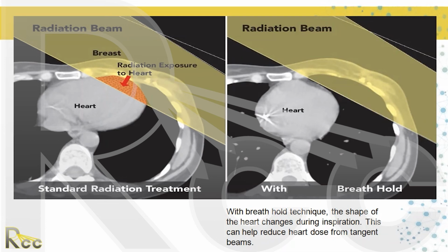So the doctor is responsible for defining the tumor, and the doctor has to know how far beyond the visible tumor cells have spread. And then the physicist has to help the doctor understand the penumbra of the beam and how close to the edges you can get, and that determines the planning treatment volume, the PTV. Now, the PTV is what's going to be treated, and hopefully it's as conformal as possible. I'll give you some examples from our clinic.